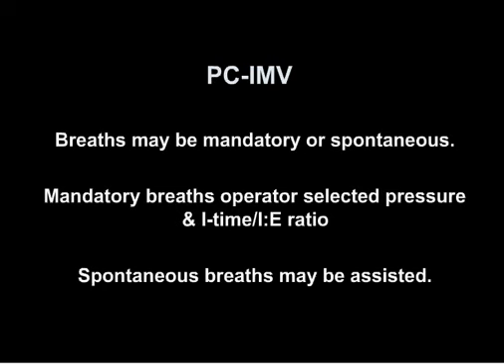Now, pressure control IMV. With pressure control IMV, breaths may be mandatory or spontaneous. The mandatory breaths are operator selected pressure, and the I time and IE ratio is constant also. And your spontaneous breaths may be assisted.